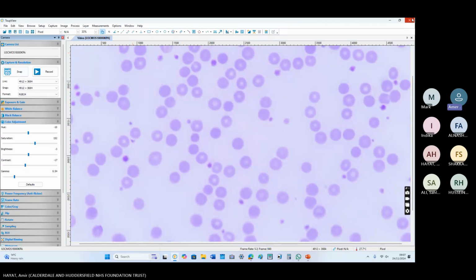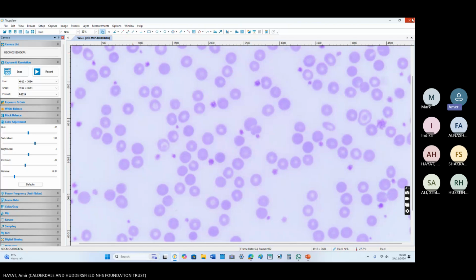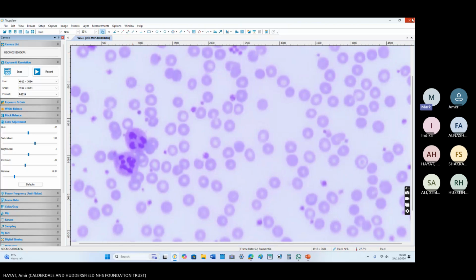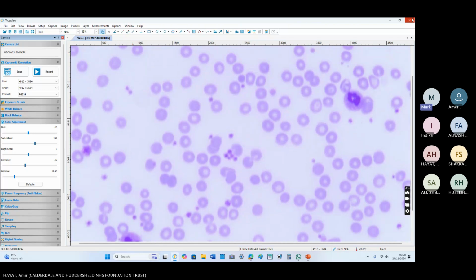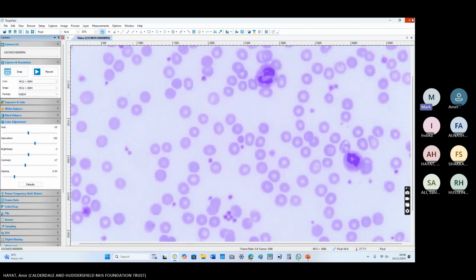So how will a lab person report it? Let's see a few more sections. If you say lab neutrophilia with thrombocytosis, query sepsis. There's platelet anisocytosis. You know, there's one or two spherocytes about too.